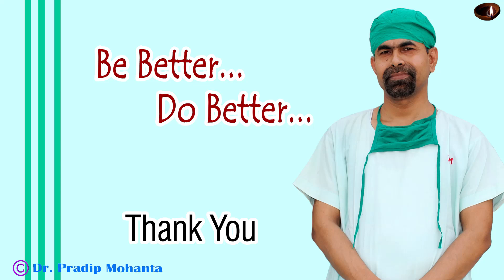Thank you very much for your attention. So when you are not using a pre-chopper — if you don't have a pre-chopper, or you think it is an additional instrument you don't want to buy — this is the technique: use zero vacuum, engage the handpiece, just support the lens nucleus with the handpiece, and use your chopper to travel from the periphery to the tip of the phaco needle and do a mechanical chop. Chop. Chop. Chop. Thank you.